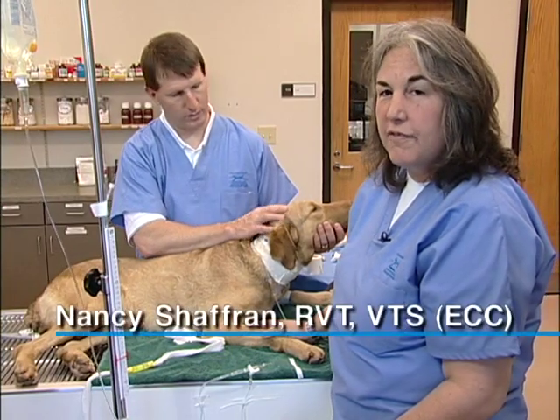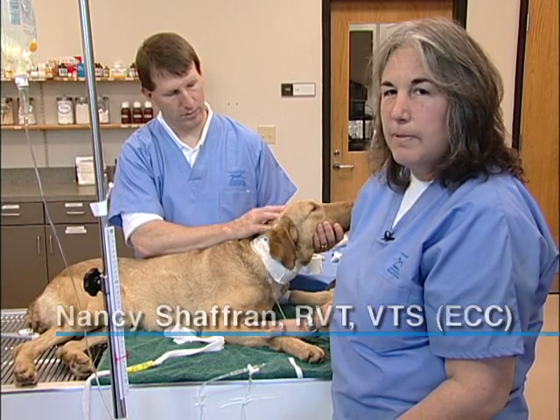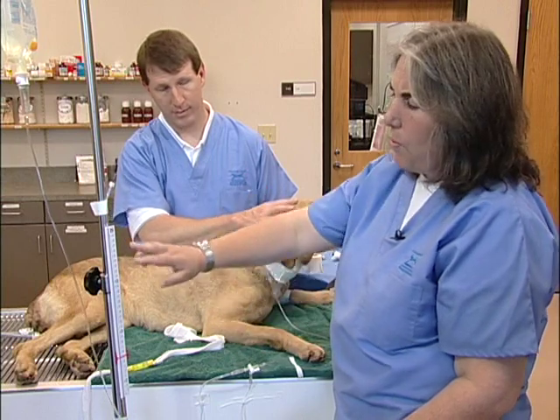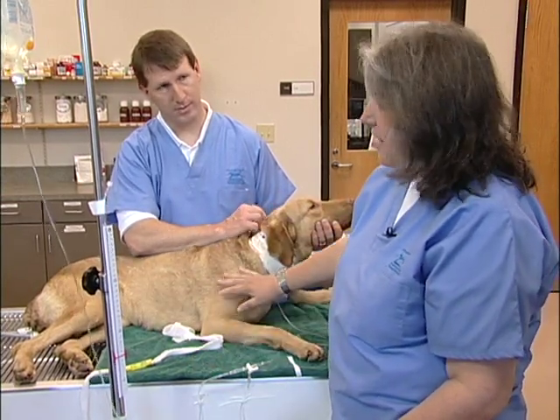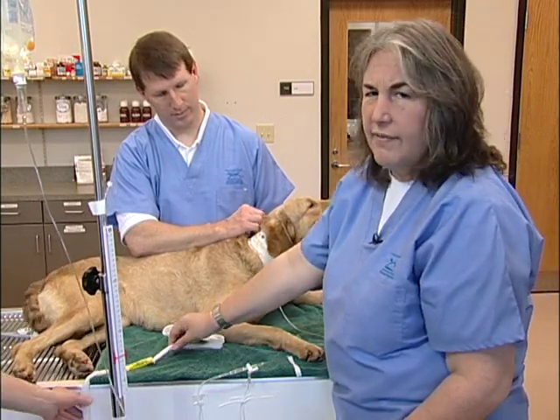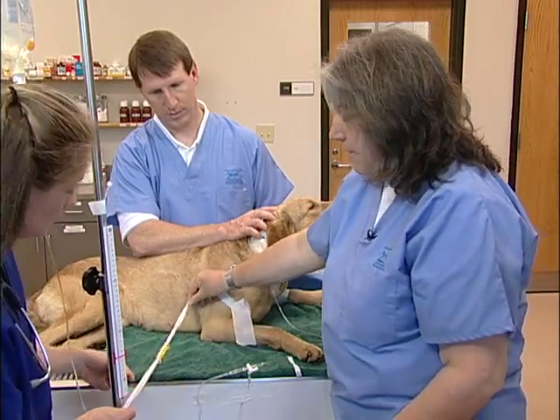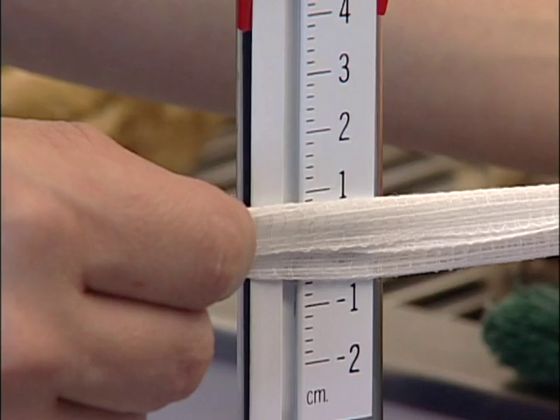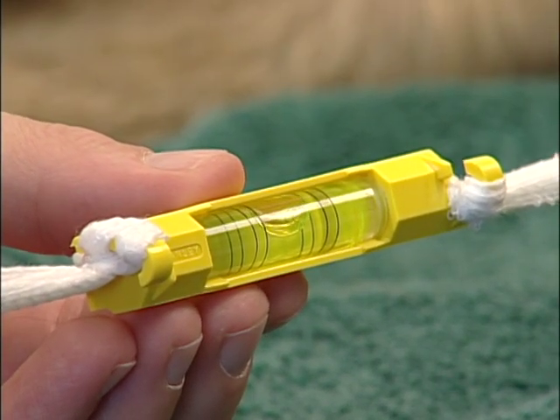We're going to set up a central venous pressure monitoring system on this dog right now using a simple water manometer system. The first thing I've done is set the water manometer here with the zero level right even with the dog's right atrium. I've used a line level to show me where that zero mark should be, and by holding one edge against roughly where the dog's right atrium would be, I can set the zero mark so that it's level with that right atrium.